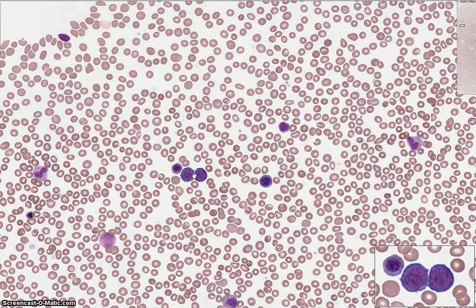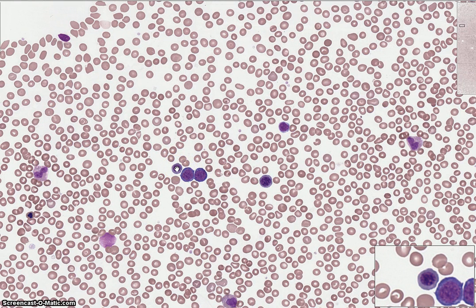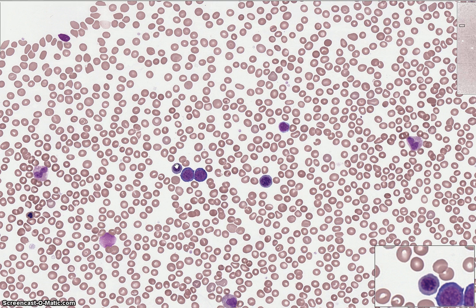Here we have two basophilic normoblasts. These cells are a bit smaller than the pronormoblast, and though the cytoplasm is still a deep blue, it's not quite as dark as the pronormoblast. The nuclear chromatin is starting to clump a bit and it's fairly uniformly clumped throughout the entire nucleus. The shape of the basophilic normoblast and its nucleus is very round.